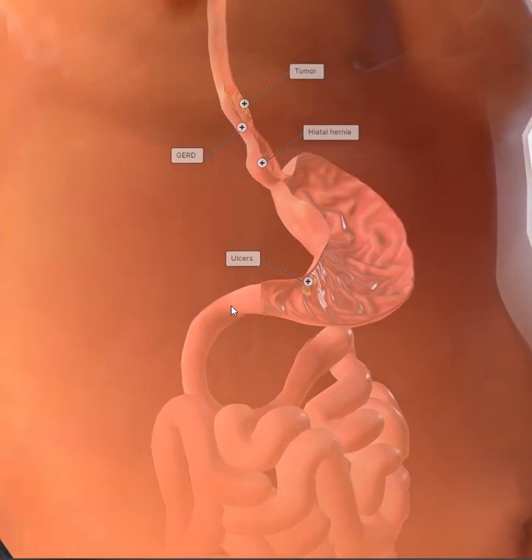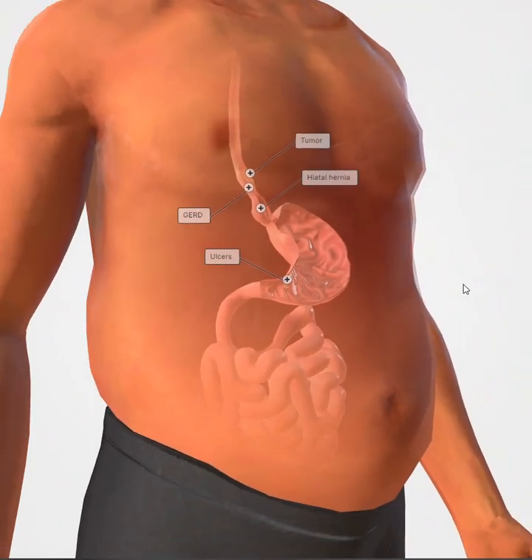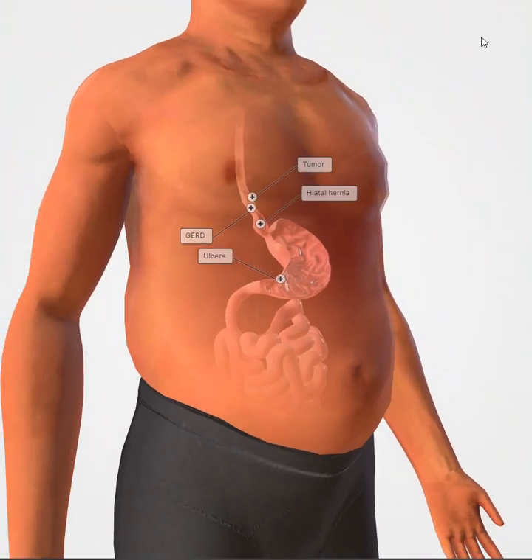See, now we'll see it in profile. Now we'll see the duodenal bulb in profile and the C loop in profile. LPO position. All right, now if we imagine, instead of the whiteboard being the table, that we're under the table looking up at our patient and he's lying face down on the table, that would mean that his right anterior side is against the table, and that would place him in an RAO position.